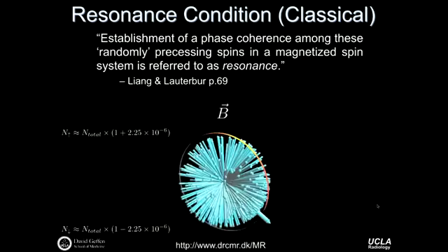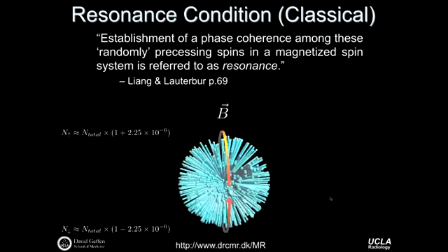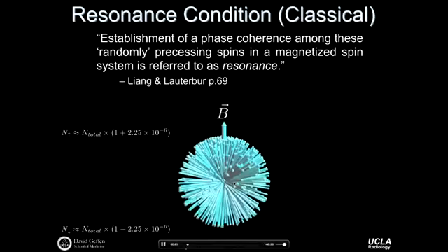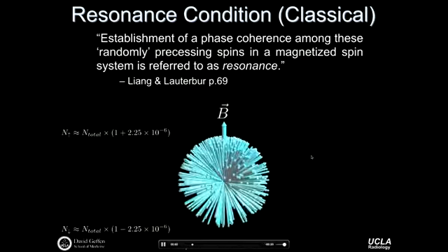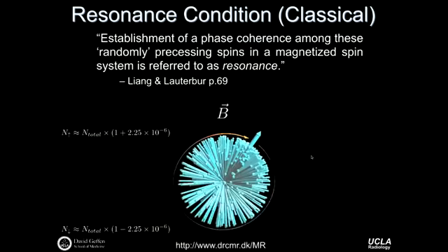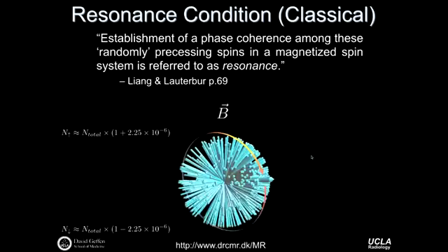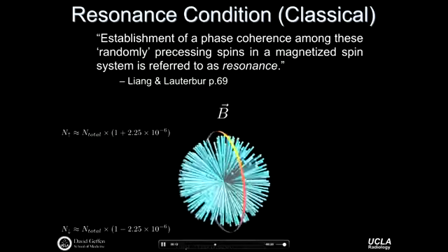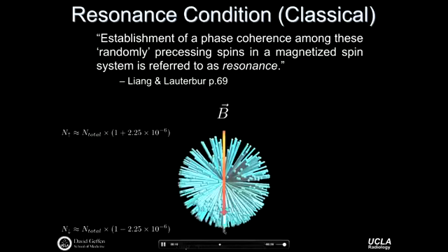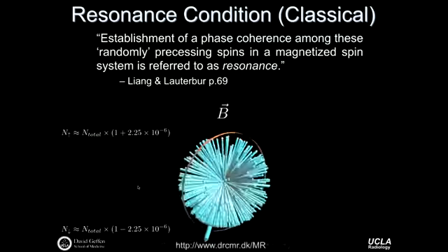And eventually, if you turn that RF pulse off, the spin system will relax back to some other state. So I think this is a good picture to have in mind of what's happening to lots of magnetic dipoles as they're being acted on by an RF pulse. What we really care about, and what we're going to keep track of in this course, is just what's happening to the bulk magnetization vector, which is the ensemble behavior of all these underlying magnetic dipoles.